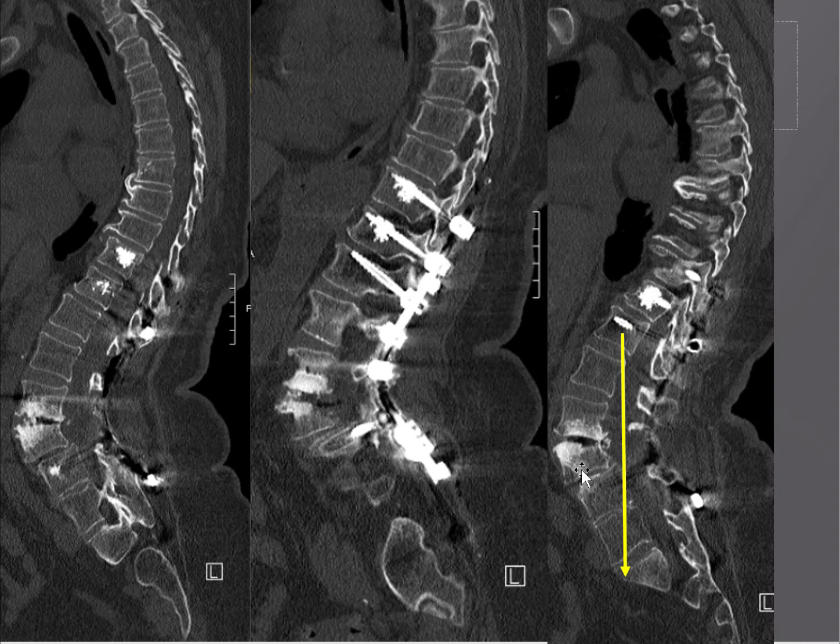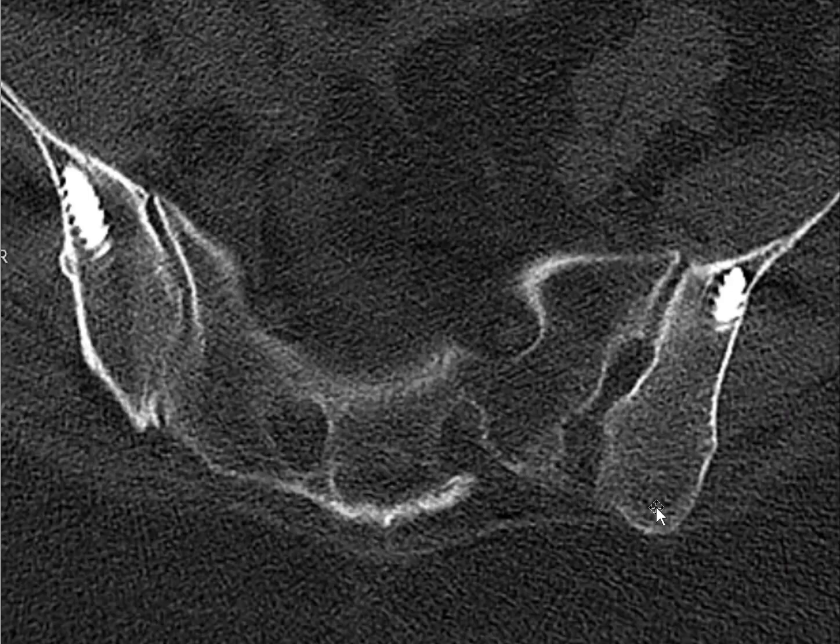Also note that at L2-L3, it's through the disc base, and the posterior cortex of the vertebral bodies are closed down. I mean, in retrospect, I think it would be nice if we could have inserted a cage anteriorly to increase the rate of fusion and also maybe get a little more lordosis, but that would add more time to the case. So it's something to think about, inserting a cage anteriorly at the level of your pedicle subtraction osteotomy to ensure fusion.